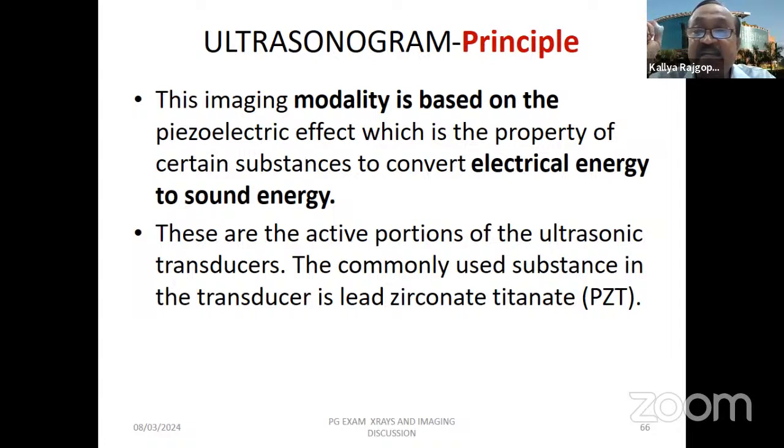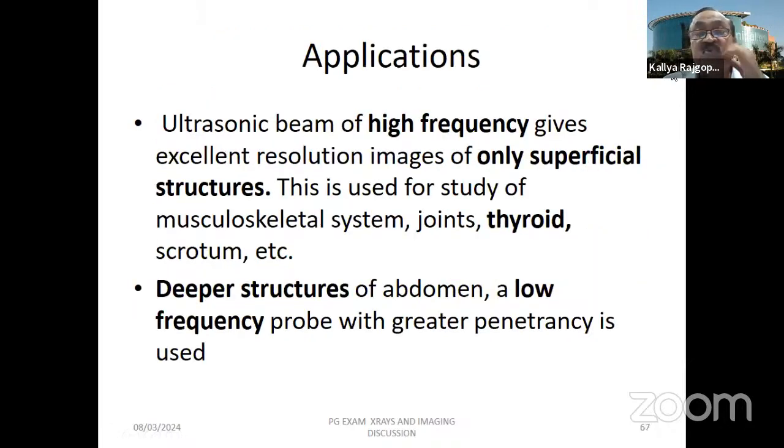This is the one modality which came in a big way. It is basically the piezoelectric effect, which is the property of certain substances to convert electrical energy into sound energy. These are the active portion of the ultrasonic transducers, and a commonly used substance is lead zirconate titanate, that's PZT.